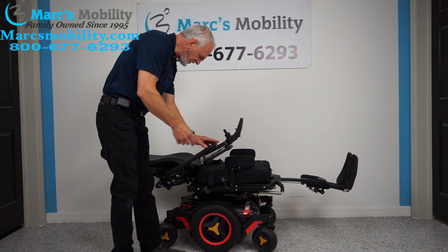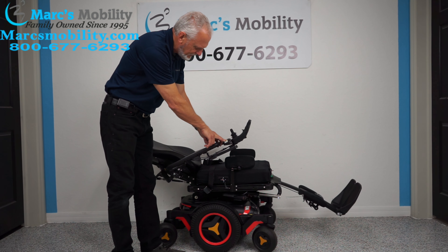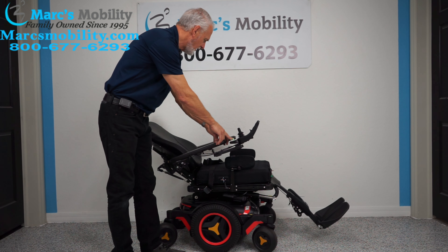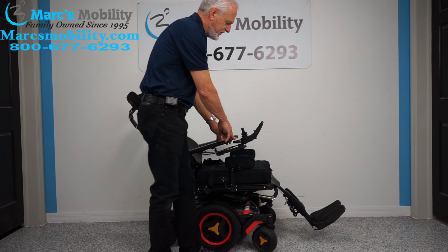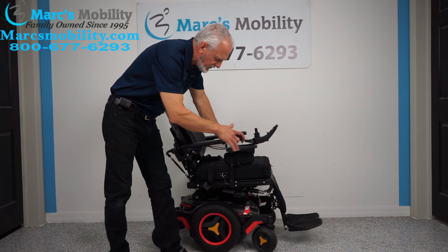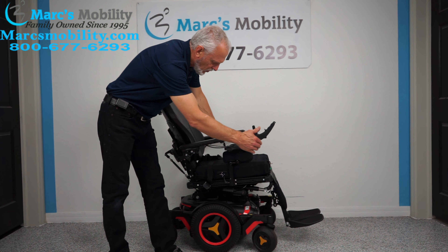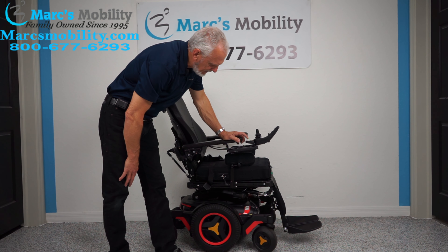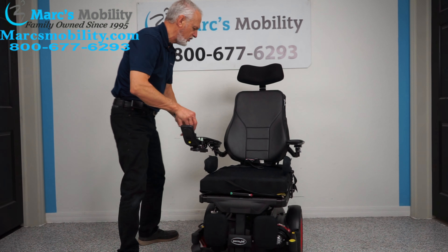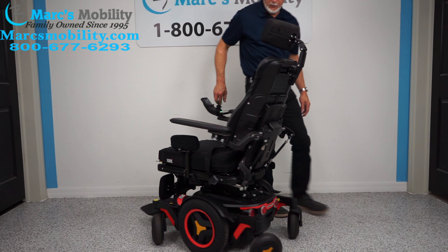Now I'm bringing the back back up and the legs back down using two buttons. If you're using the joystick you can do everything with one button. If you're outside, leave your legs out a little for more room under your feet. On this model, to get the legs all the way in you need the seat tilted slightly. Since it's a mid-wheel drive, you get a very good turning radius in the house.